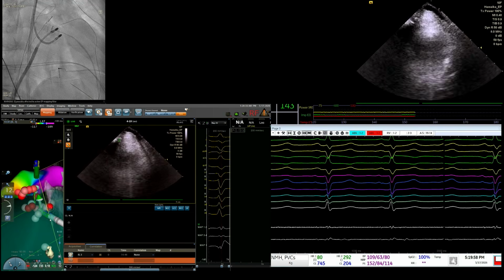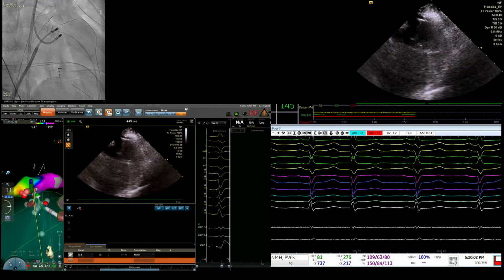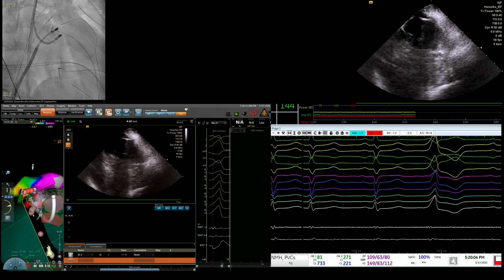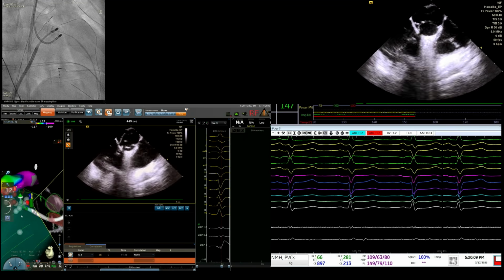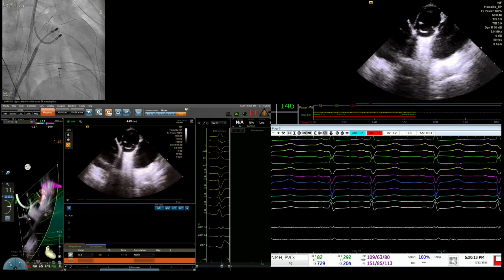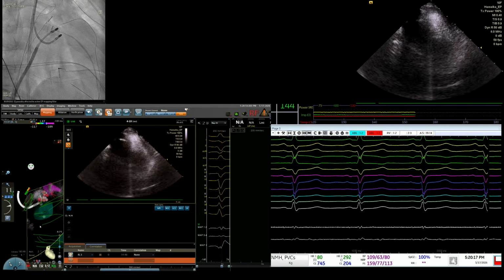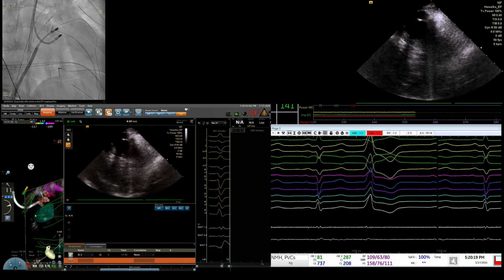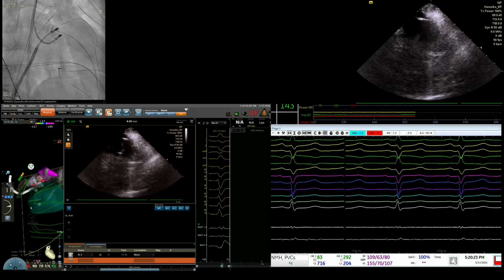So I'm going to go back. Okay, I'll show you here. These are the cusps, you see that? Do you see the catheter going in the middle? This is the left coronary cusp right there and the left main. So I slowly open the window. This is below the left coronary cusp, and opening more, you see my lesion starts to show right there.